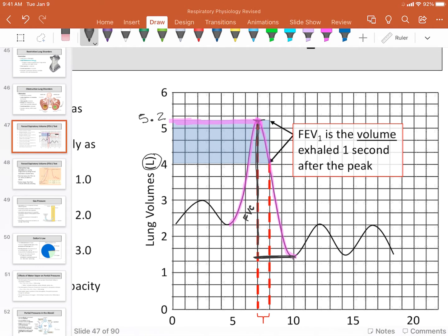And then again, follow the bottom line down here, and so maybe this is, what would that be? Maybe 1.0, we'll say 1.4. And so the difference between this, to calculate my vital capacity and forced vital capacity, would simply be 5.2, which is my maximum, minus that 1.4.